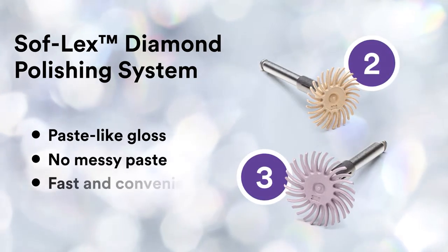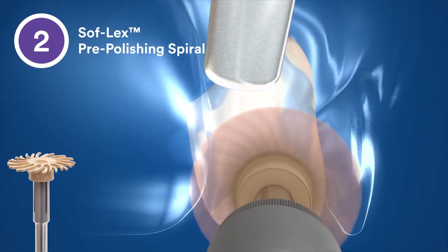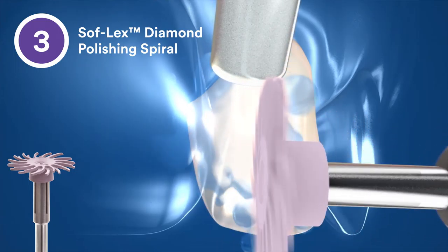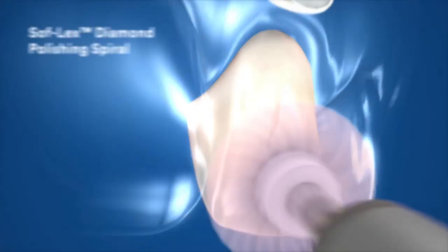The Soft Flex Diamond Polishing System lets you create a diamond paste-like gloss without the messy paste, and with the convenience of a rubberized system. The beige Soft Flex pre-polishing spiral smooths and removes scratches, preparing the surface for high-gloss polishing. The pink Soft Flex Diamond Polishing Spiral contains tiny diamond particles to create a smooth, high-gloss polish.